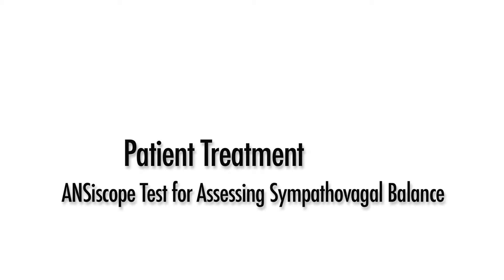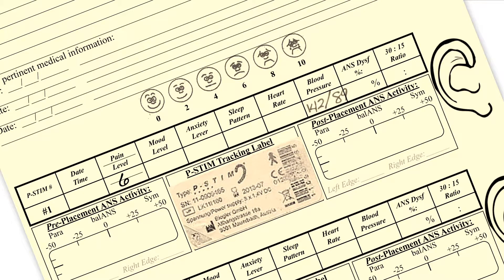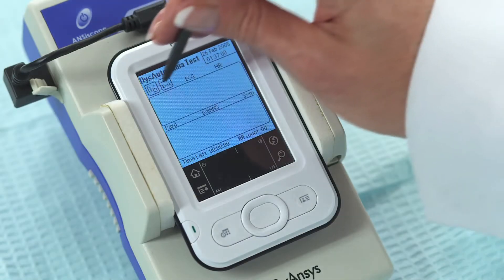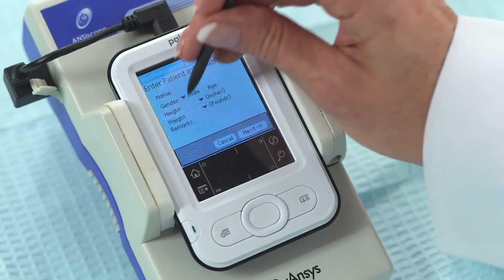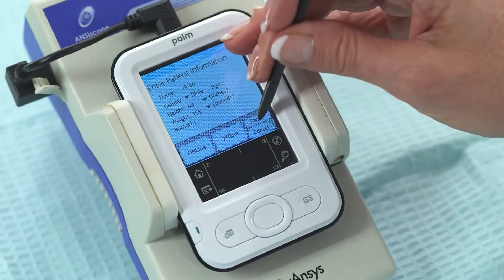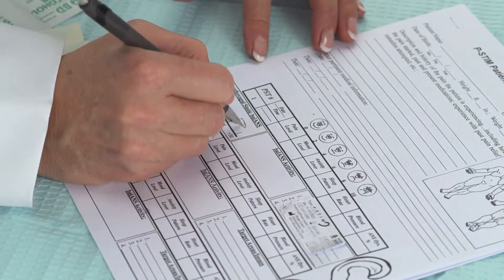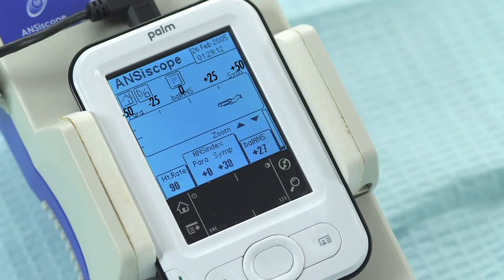Anciscope Test for Assessing Sympathovagal Balance. This test is used to optimize p-STEM placement and is kept on during the entire p-STEM procedure, which takes approximately 15 minutes. Record the patient's pain level and blood pressure on the patient tracking form. With the Anciscope attached to the patient, select the Data button and enter patient data. Select Online and then Start. In about 30 seconds, the Sympathovagal Balance trajectory will appear. Draw the trajectory pattern on the pre-placement ANS activity section of the patient tracking form. Also estimate the values of the left and right edges of the trajectory. In this example, the left edge is plus 18 and the right edge is approximately plus 37.